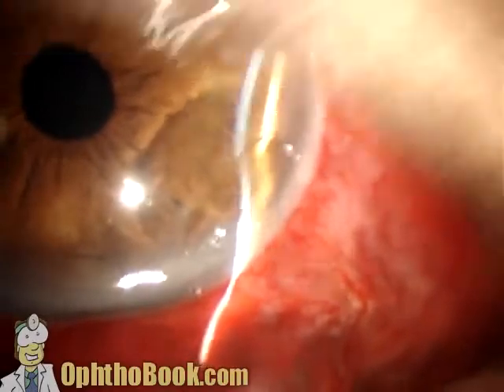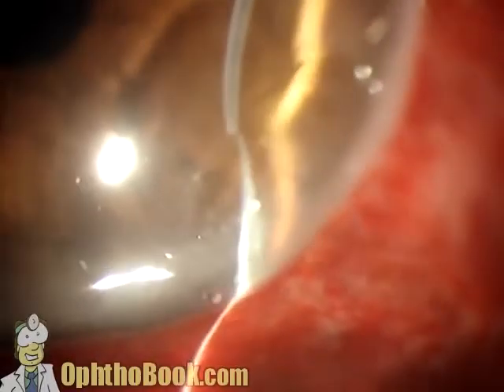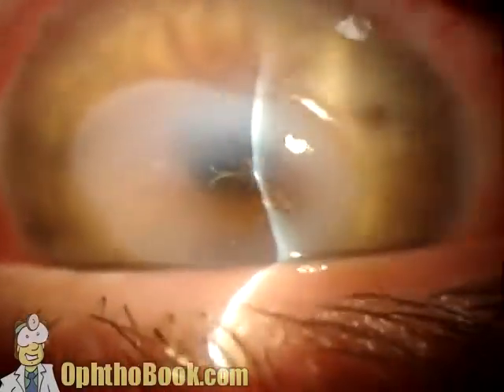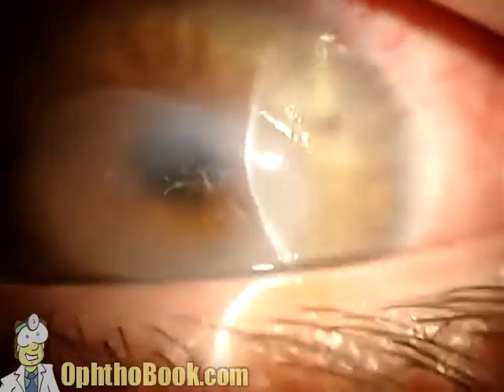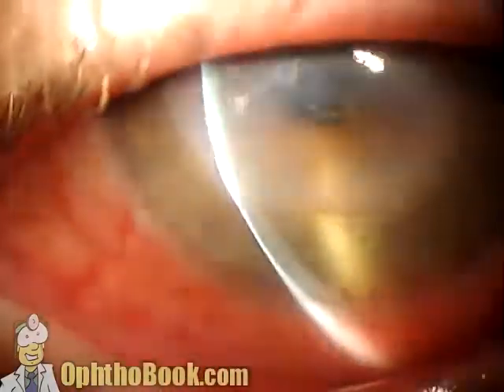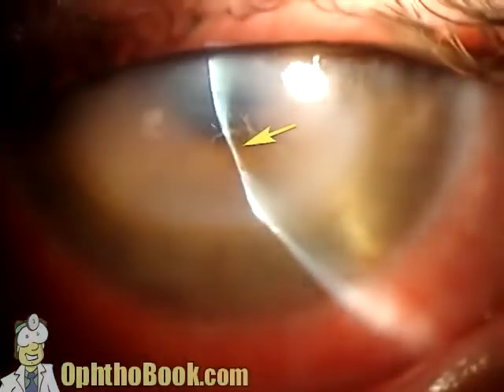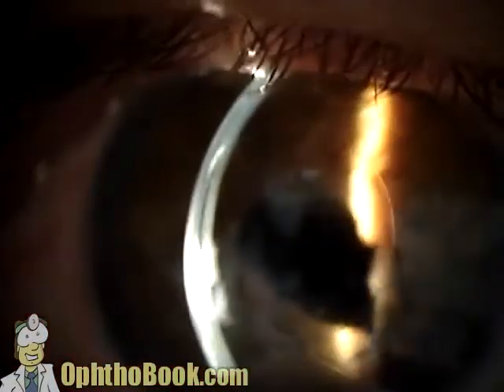Moving on to our cornea. This is a Dellen, an area of localized dryness that has caused thinning of the cornea right in this one little spot. Hydrate this and it thickens back out again. This, of course, is a corneal ulcer, and it's thinning right in the middle. And we know it's thinning because look how clear it looks right in the middle of this lesion. And when we move our slit beam across it, just look at how thin it gets at that one spot. It ended up perforating a few days later.